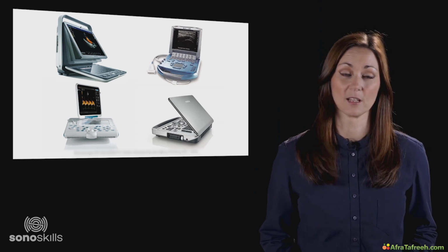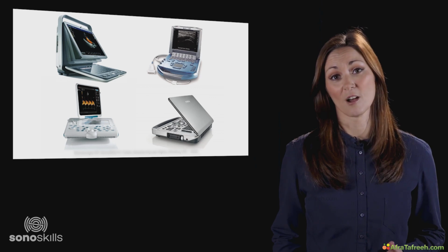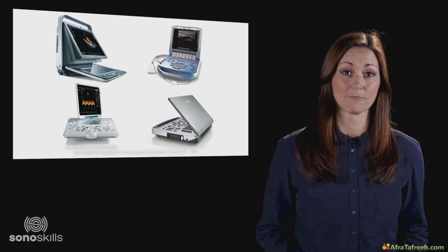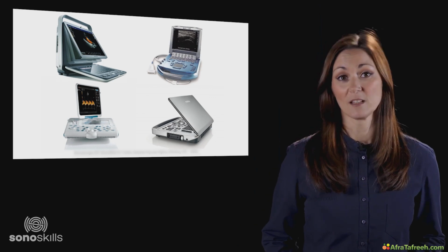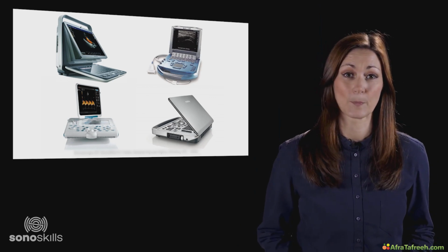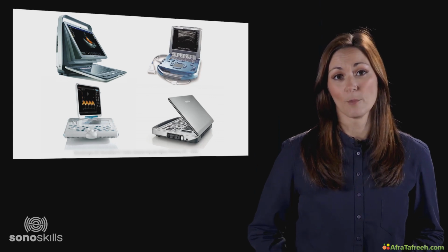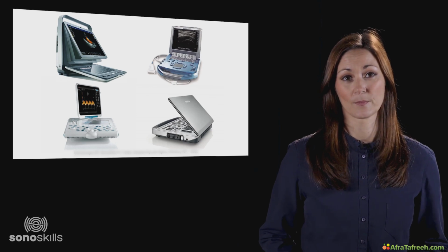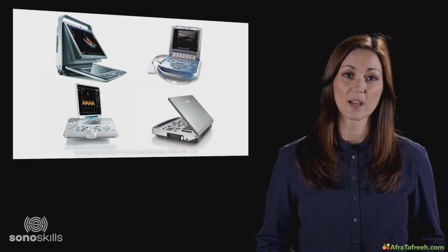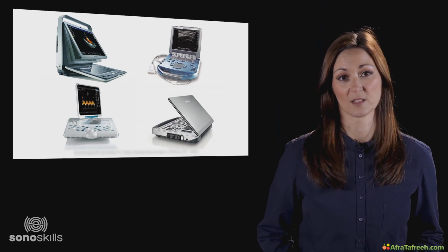There's a big variety in ultrasound equipment. There is a variation in price, size, and portability, quality, and functionality. Some have a touch screen, other systems have buttons. The ultrasound systems commonly used in primary care are mainly the laptop systems as seen on this slide. It provides the healthcare professional with a relatively affordable, easy to use, portable system.